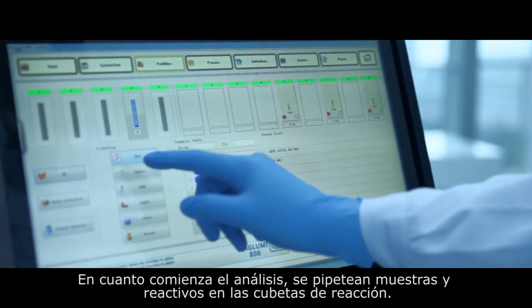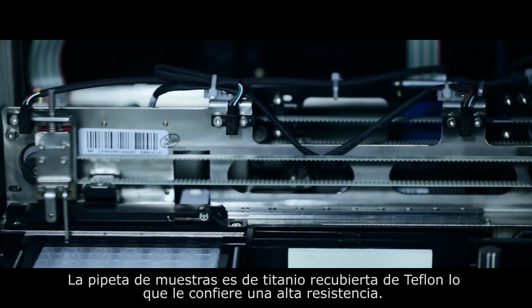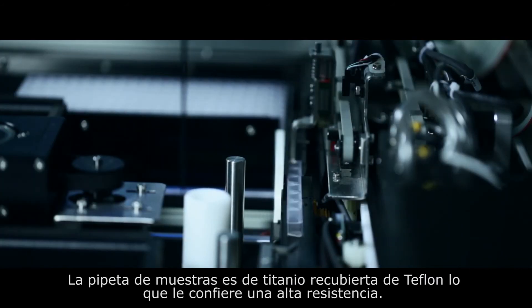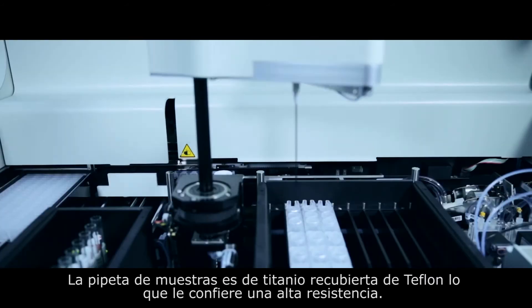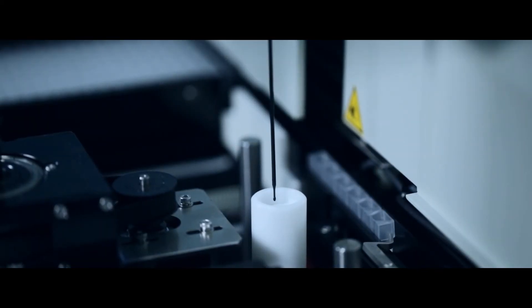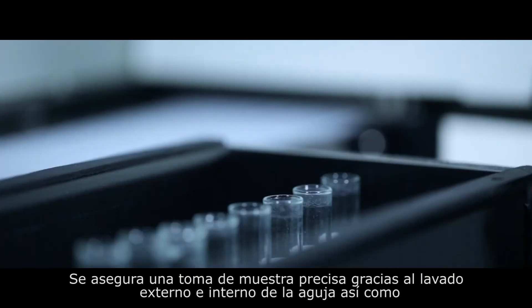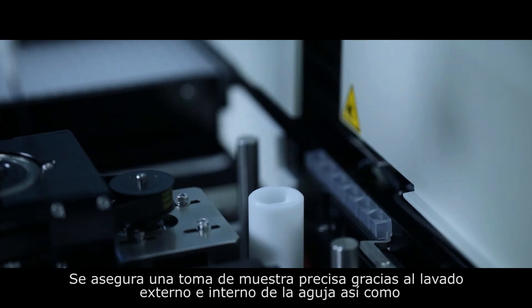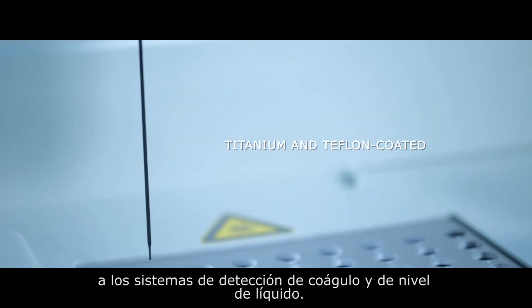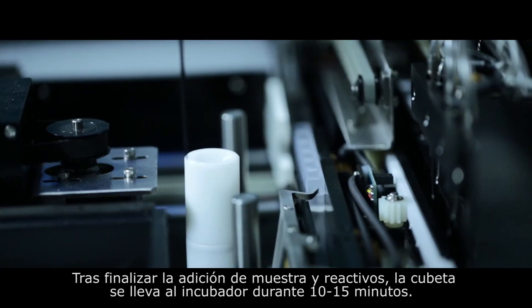After confirmation of the work list, click the start button to begin the test. As the test commences, the sample needle pipettes the sample and reagents into the cuvette. The sample needle is titanium-made and Teflon-coated, providing crash-proof performance, with internal and external washing plus liquid level and clot detection to ensure accurate pipetting.